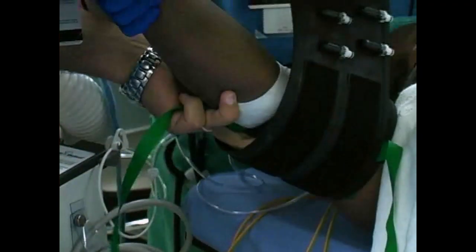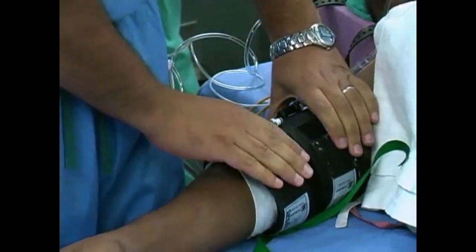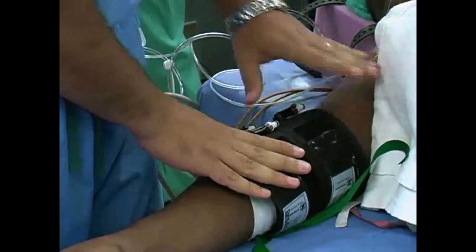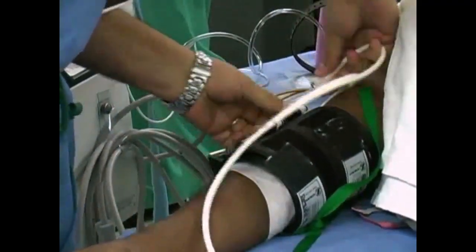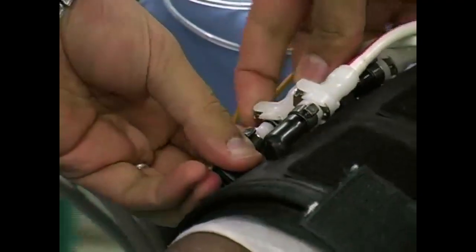When the cuff is properly placed, re-identify the two cuffs. Looking at the tourniquet, notice that there are two bladders — this is the distal cuff and this is the proximal cuff. Connect the cuff to a pressure source to provide air for inflation. The proximal cuff is connected to the blue hose and the distal cuff is connected to the red hose.